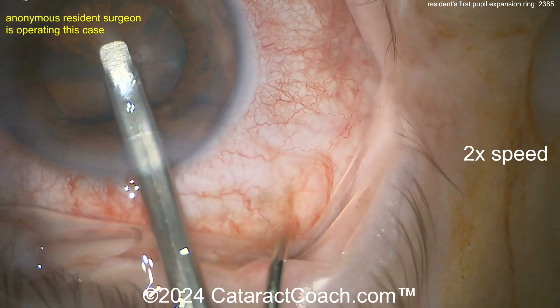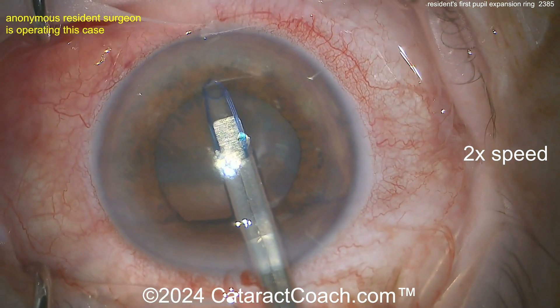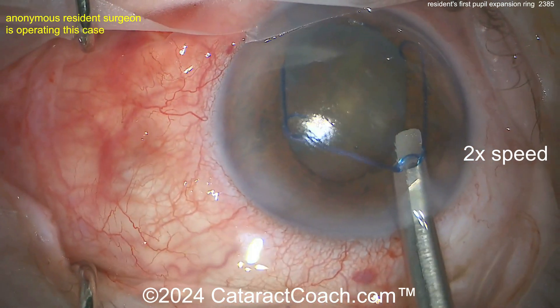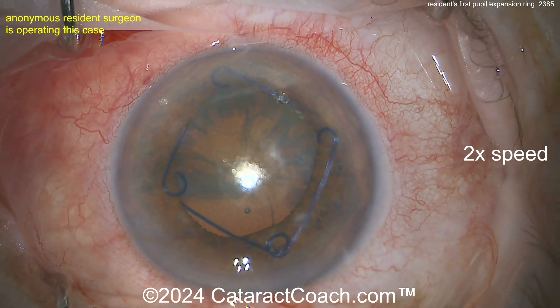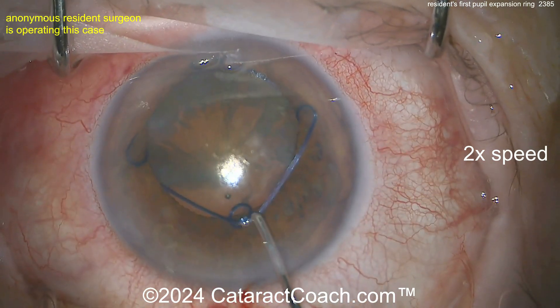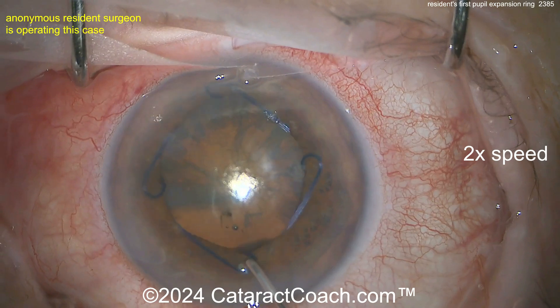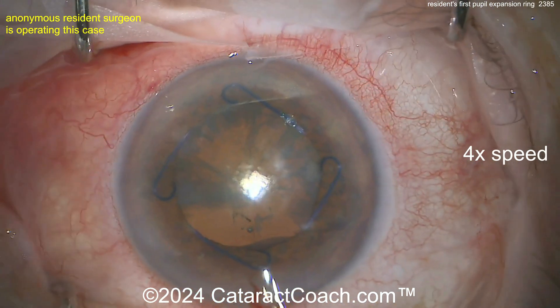Alright, it's in position. Center up the scope, please. There we go — there's the leading scroll caught on the iris margin beautifully. Here's the right side and the left side; get that angle correct. Beautifully done. You could even have that last scroll placed if you put your second instrument through the side port, but let's place it here. That looks great — center it up. You've hooked it. Beautifully done, very nice.